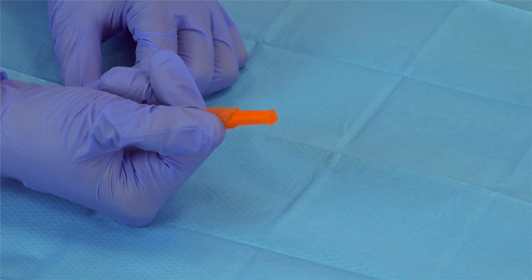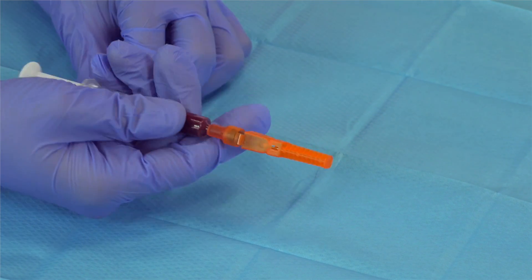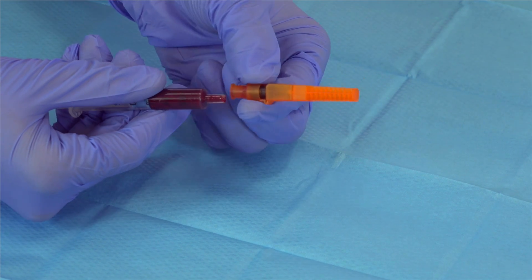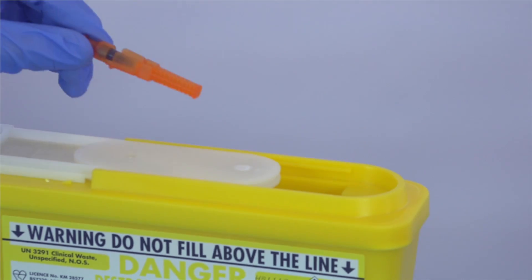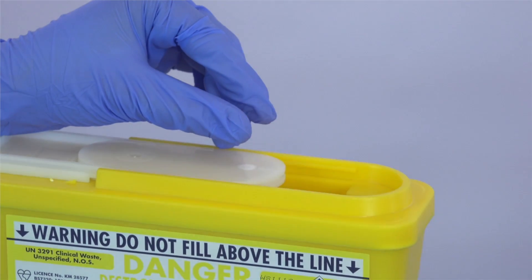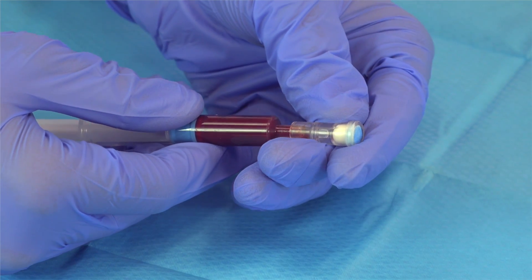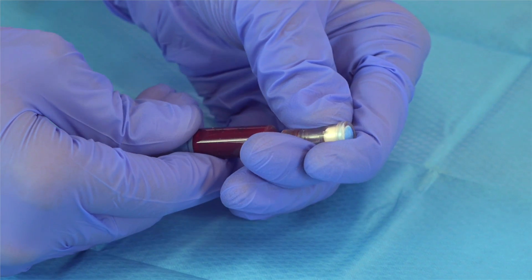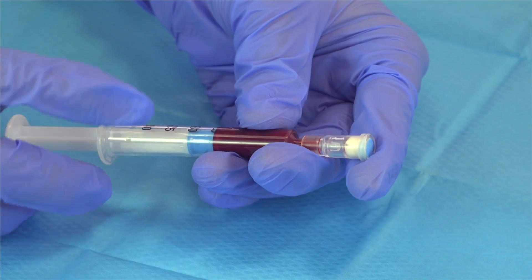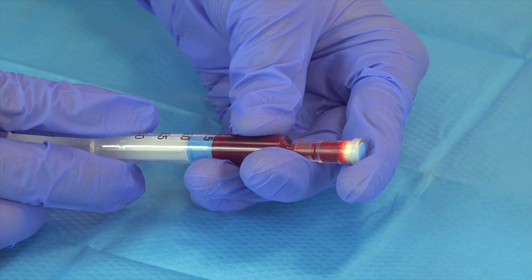The needle should then be resheathed, detached from the syringe, and placed into a sharps container. The syringe is then kept, and having safely tidied and disposed of our equipment and washed our hands, we can then take the ABG sample for analysis.